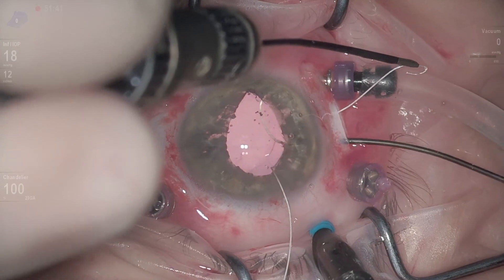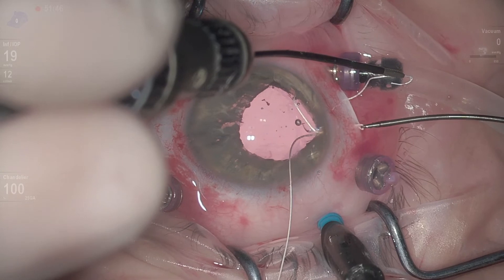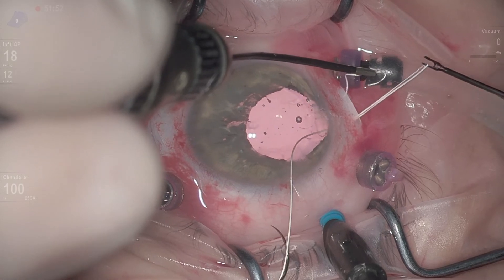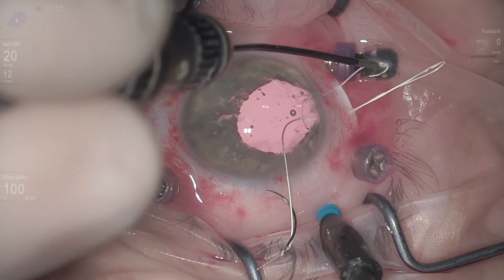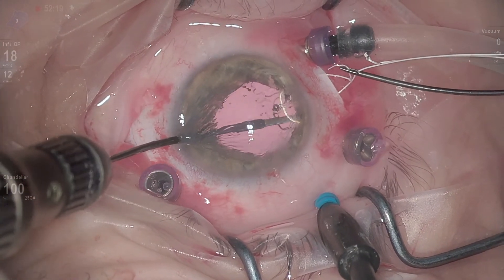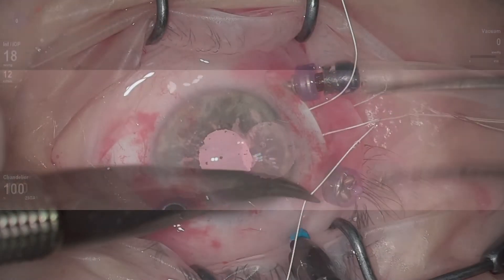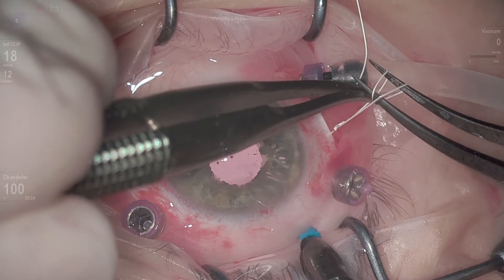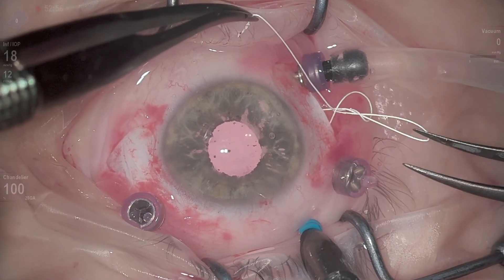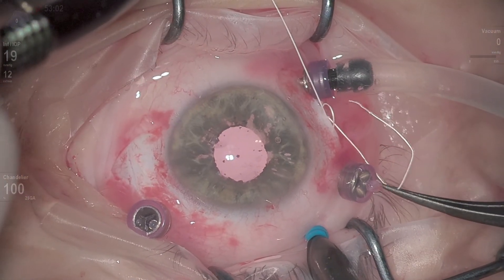I pass the Gore-Tex suture in the same fashion as we would do with the Acreos AO. Now I will put the IOL behind the iris. The fixation will be the same — it will be stable, there will be no tilting, and it will be placed at the intended position, which was the original fixation point. The only difference is that now we have a Gore-Tex suture under the scleral pocket.